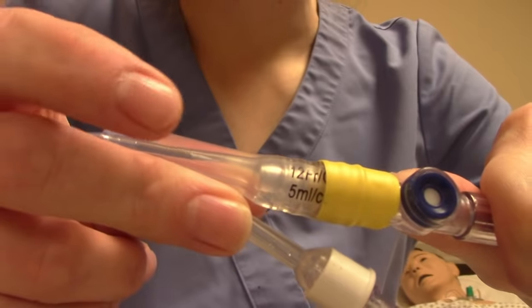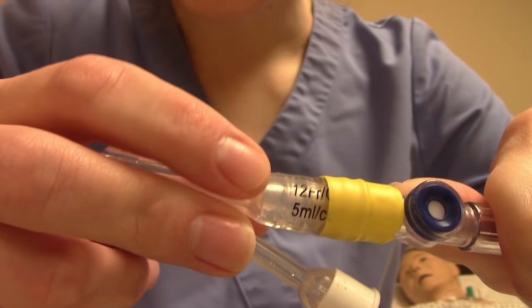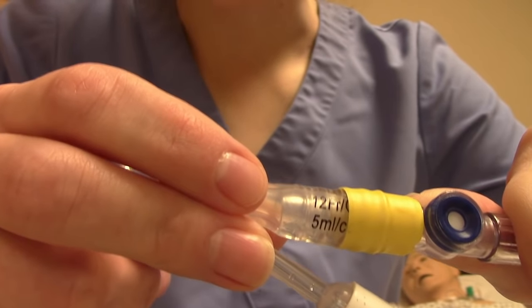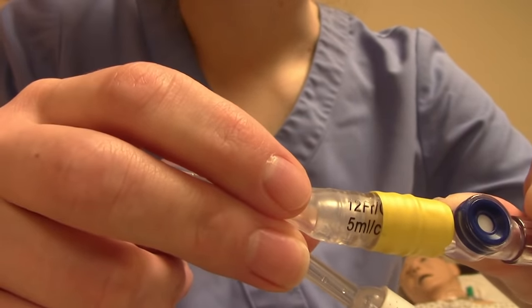Just like it says on the packaging, it also says the French size and balloon volume on the tubing itself — every catheter should say this. When you go to document, make sure you're recording what French size you used — 12, 14, 16, whatever — and you can find that information on both the tubing and the packaging.